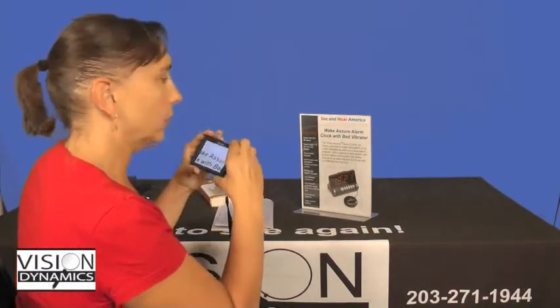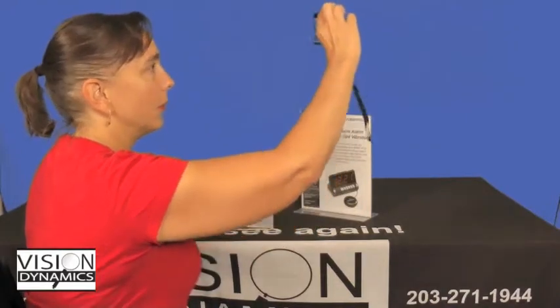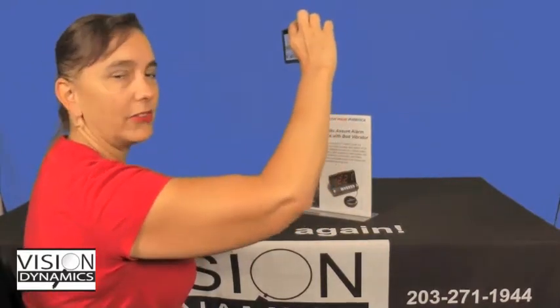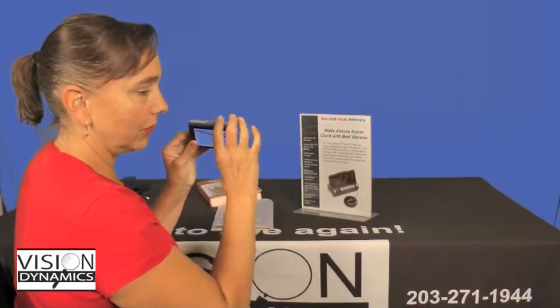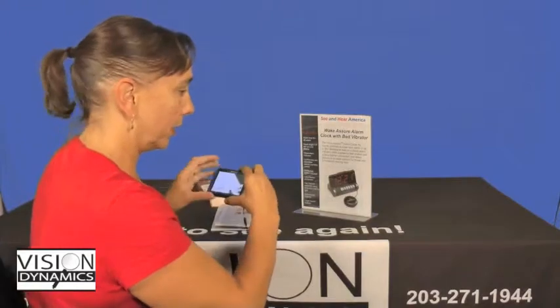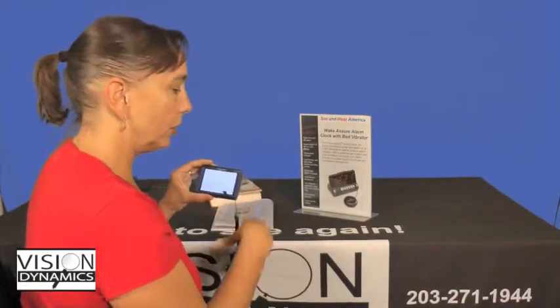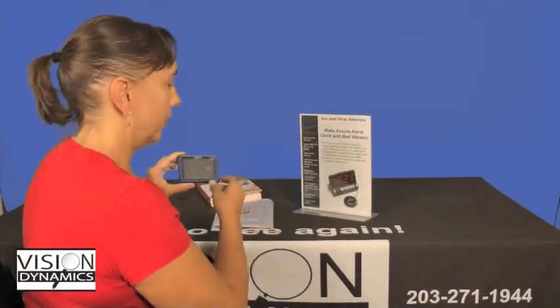And then as soon as I'm done looking at that price tag, or whether it's the men's room, the ladies' room, and I can't quite see the sign, I just press that top button again, located in the top center of the Mini, and the screen is back to live mode, what we'll call it. It doesn't save any of the images, you don't need to, it's just a quick capture, get a closer look at your image, and then you're ready to go.